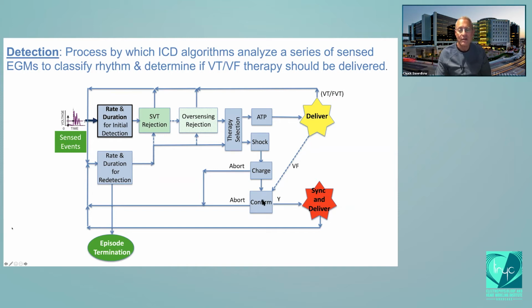And this can be a little trigger happy, because you don't want to miss real ventricular fibrillation from undersensing. And if the arrhythmia is still present according to the device, then you deliver the shock.